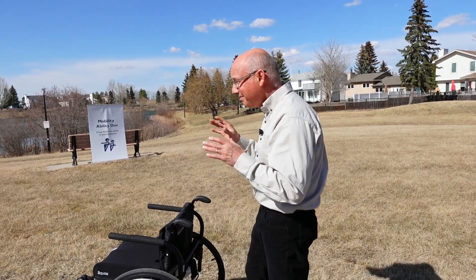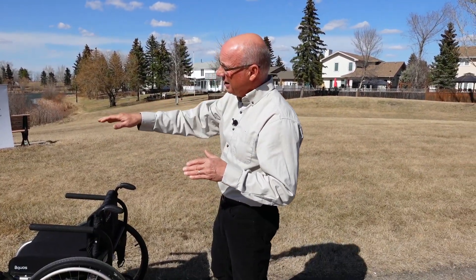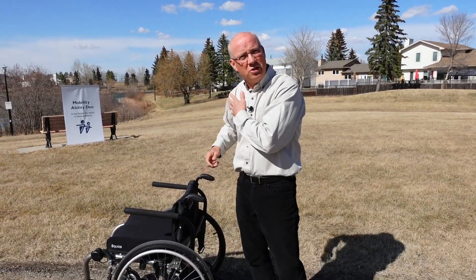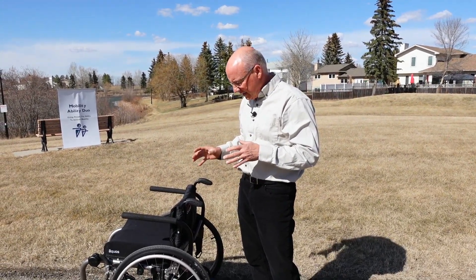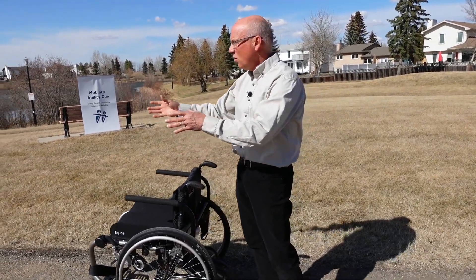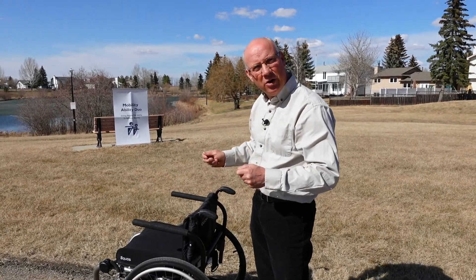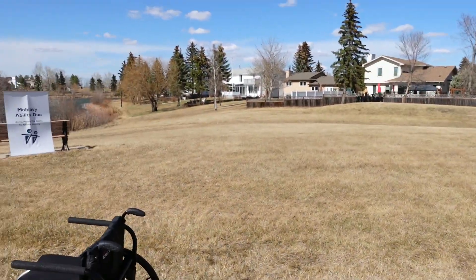People using manual chairs, especially in a setting like this, or if you want to go into the parks or you've got hills — people are wrecking their shoulders. They're getting rotator cuff problems and they're just wearing out so much. So what they've done is invented an add-on unit, a power add-on unit, just to help that. So if you just want to go, you can get the machine to do it and then you steer it with the hand rims. I'll let you do a little rundown on the switches, Cass, because you're the pro on the switches.